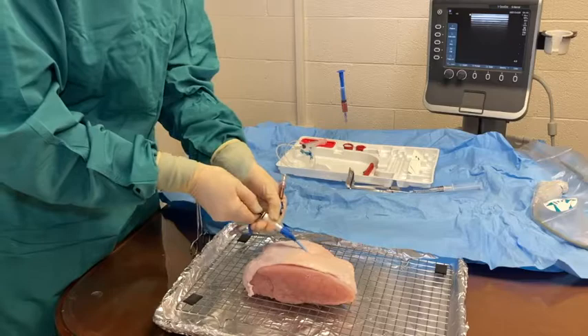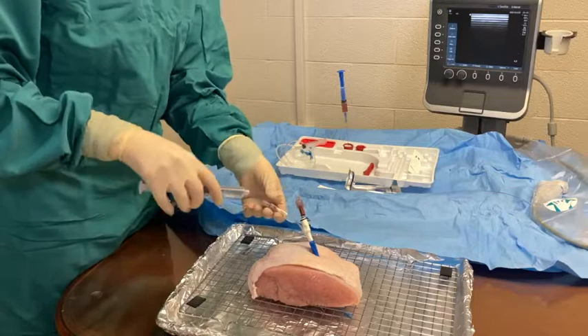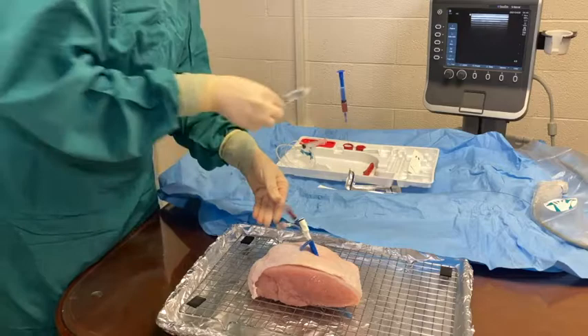You should feel pops through the layers. Once 75% of the MAC introducer is in, thread the MAC over the dilator. Remove the dilator and wire as a whole together from the center once the MAC is completely in the skin. Draw back until blood is seen in each port, then flush with saline to remove the blood.